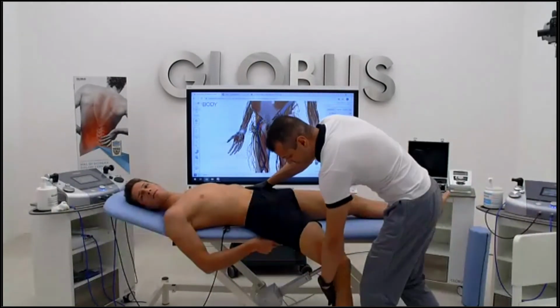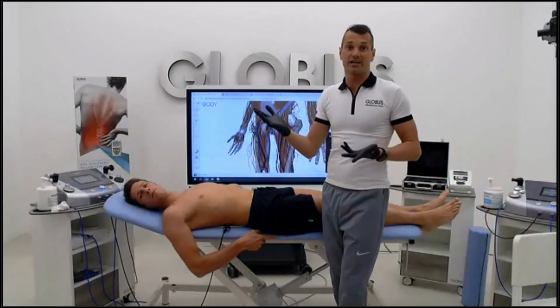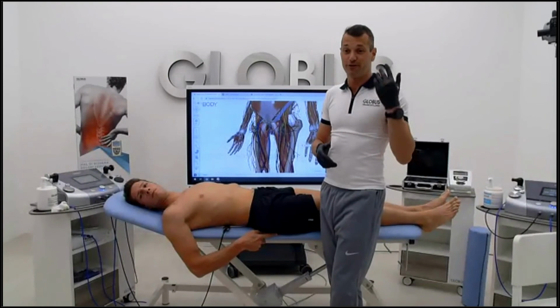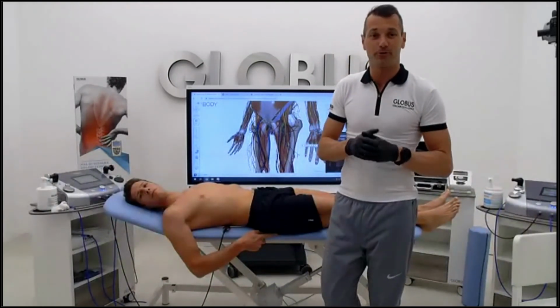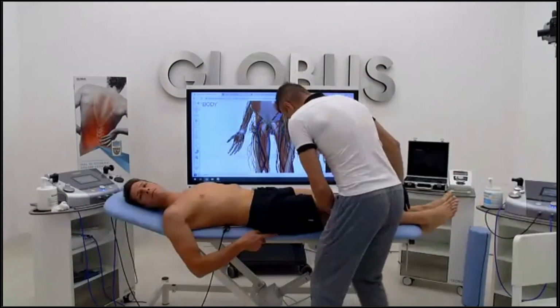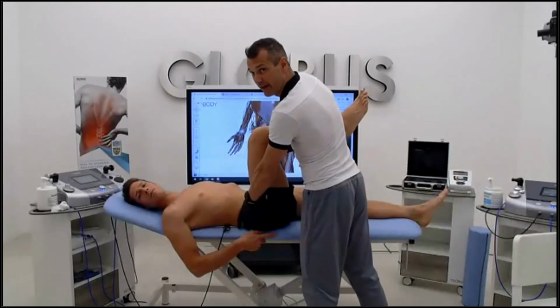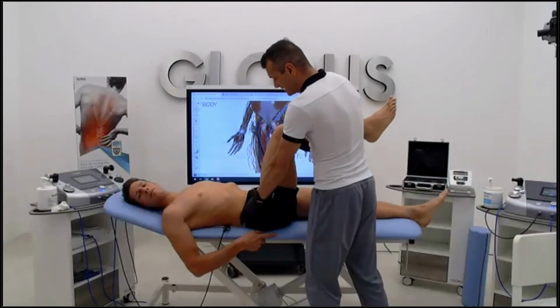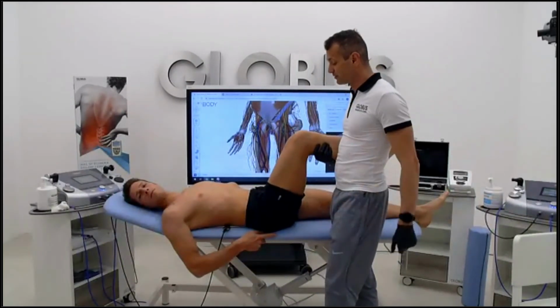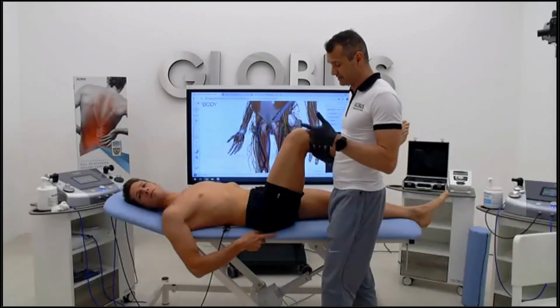So it's very easy with this kind of deep pathology to achieve great results, because usually with our hands it's not so easy. Before I had the opportunity to have this kind of tools, I needed to do really a lot of work with my hands, going deep on the iliac crest. It's also painful for the patient. It's not so easy because there is the intestine also, as we said just before. So it's not easy to properly affect the treatment and the muscle.